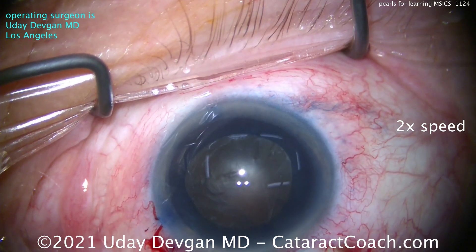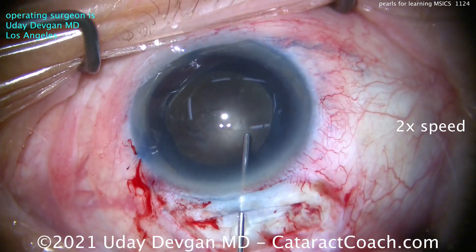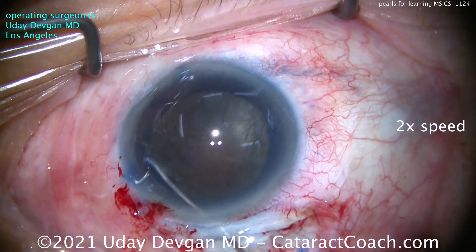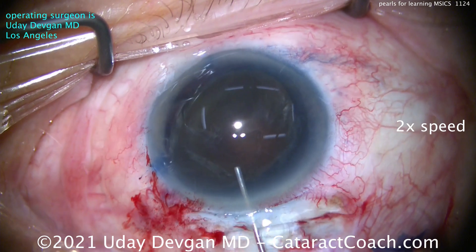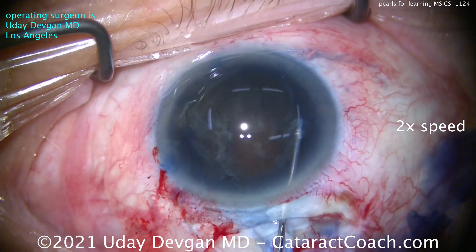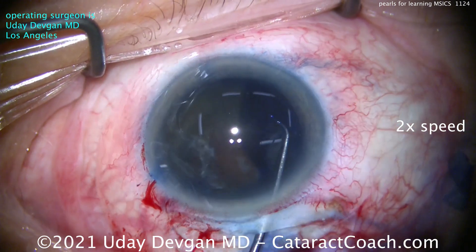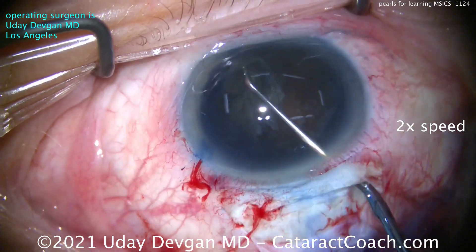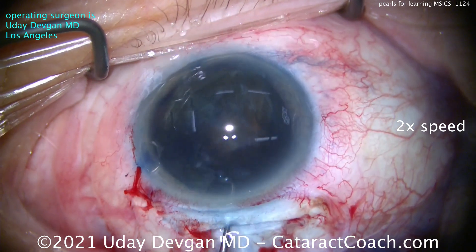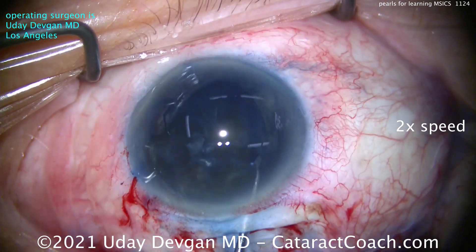By leaving the blue dye in the eye for a minute or two, it gives a beautiful stain with a lot of contrast. For hydrodissection, be careful — you can't see a fluid wave because the nucleus is so dense. Look for other clues like the nucleus coming forward. We slowly prolapse part of it out of the capsular bag, using the cannula to get the entire nucleus up. Use the chopper to help dial it up out of the bag.